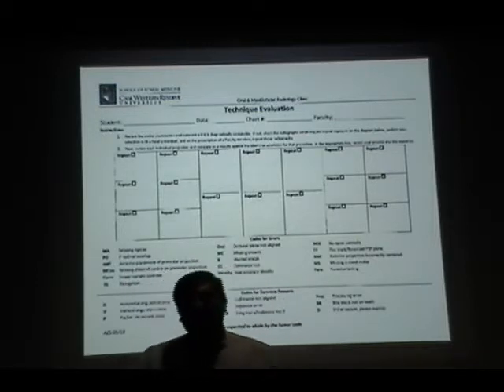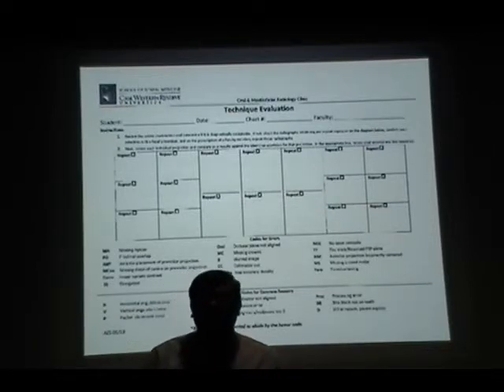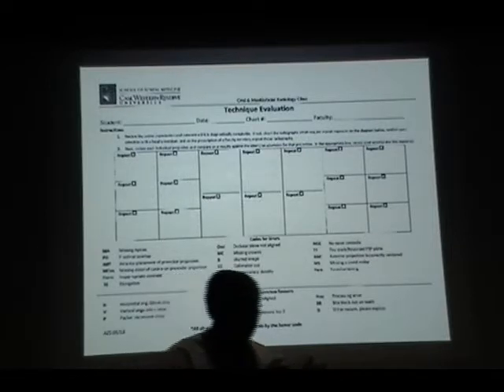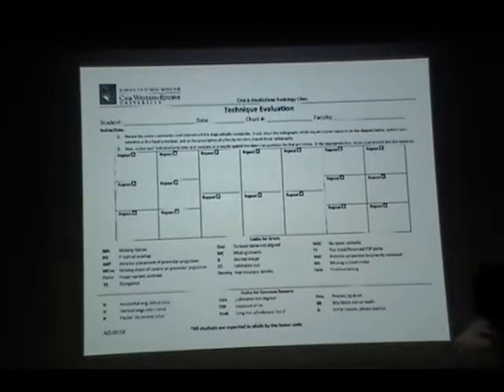Once you know that, then when you're acquiring these images on the patient, there is a limitation. We know that 14 plus 4 is 18 radiographs that constitute a full mouth series at this time. So you are allowed 5 more retakes. That means 23 radiographs is the max.